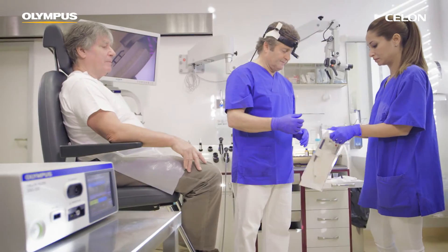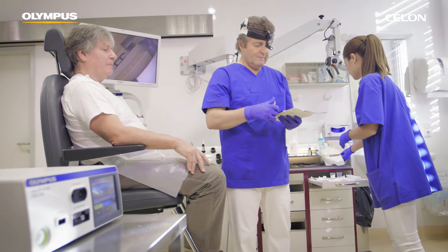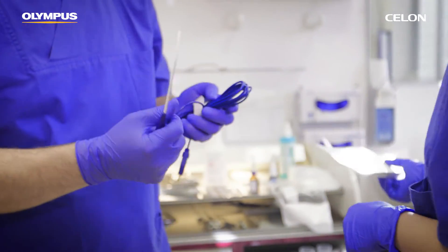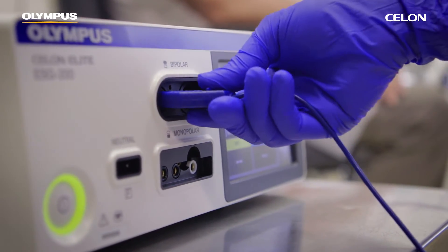Now use the Ceylon ProSleep Plus applicator to treat the soft palate. The power setting on your control unit determines the extent of coagulation induction. A power setting of 12 watts is recommended for treating the soft palate. The higher the power setting, the smaller the area of the coagulation.